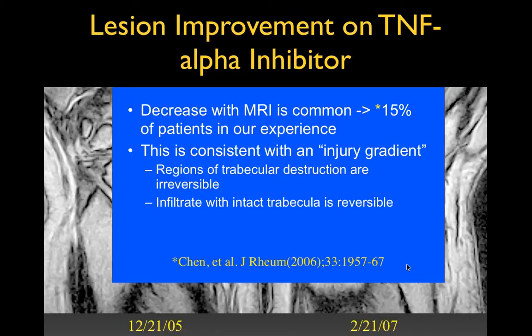Well, I think you can have both. Because every joint I've ever operated on, and I've done my share of rheumatoids, you see a lot of fluid in the joint. You see the fluid going right into the eroded bone. Yeah, most of the histology studies that I know of and the MR studies don't show fluid going into most of the rheumatoid erosions. Histology won't show the fluid because the fluid leaks out. Well, what histology shows is that it's filled with inflammatory tissue. Oh yeah. There's not a space there for the synovium to go into.